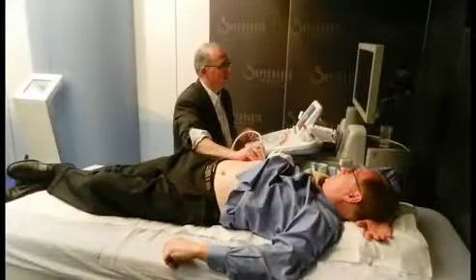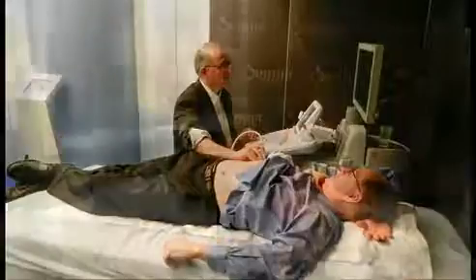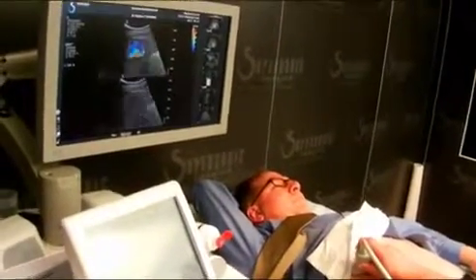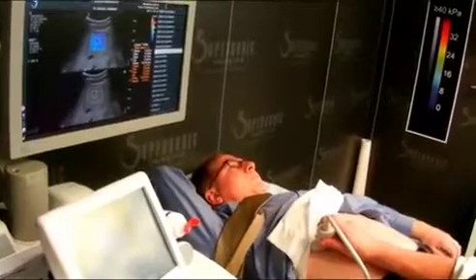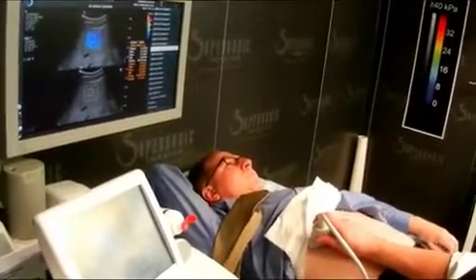When done on the Explorer, such liver evaluations take only a few minutes, according to Dr. Correus, and are highly reproducible. What I typically do is repeat the measurement three times. The previous value was between 6 and 6.2, and here we are between 5.6 and 6.2 — again a normal value.